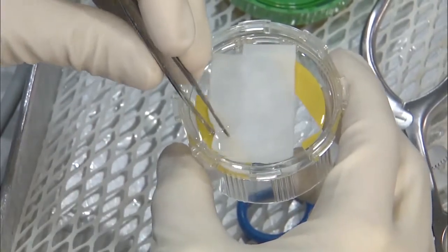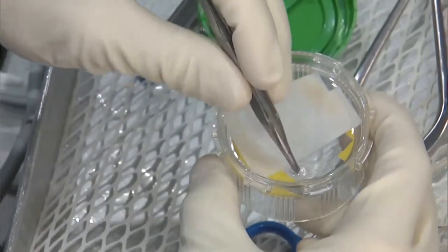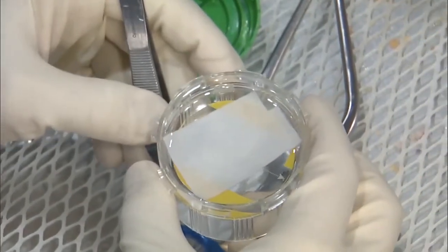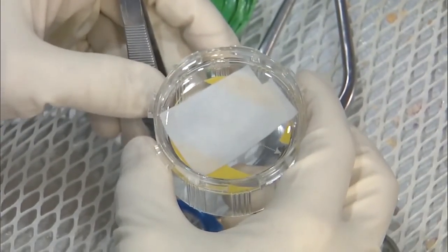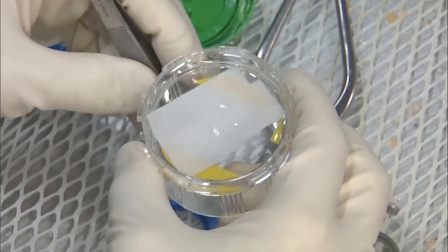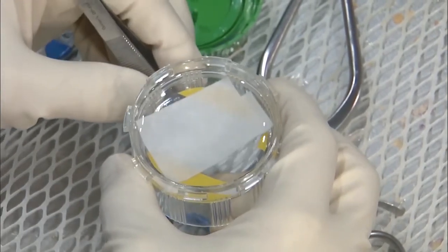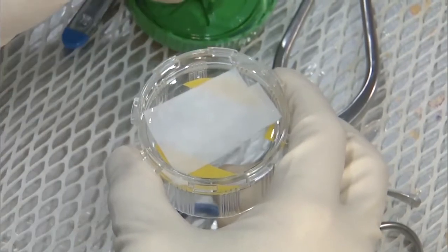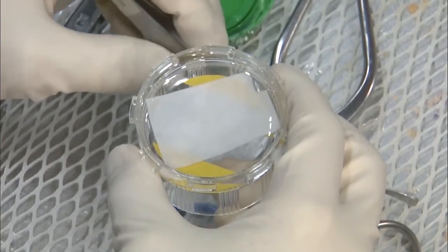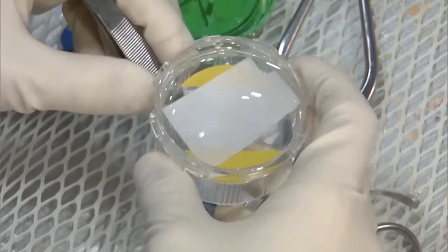Aaron, can you talk a little bit about when you're doing the biopsy, where you take it from and the depth and the amount? Yeah, so it's recommended that you either take the biopsy from the notch or from the most lateral aspect of the lateral trochlea. I typically use the standard method, which is the gouge. And you want about at least 200 milligrams. So I shoot for about 2 to 3 Tic Tacs. It's very important that you harvest all layers of the cartilage. So you really want to get down to the bone level to make sure that we have cells from all layers of the cartilage.